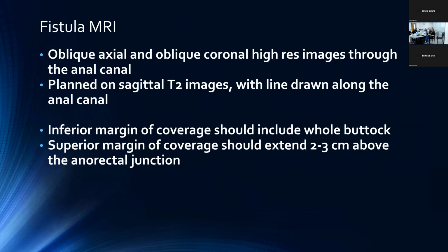So moving along to anorectal planned cases, we've decided to keep rectal tumor staging cases as RAD planned, just because these will not infrequently require review of both prior imaging and/or endoscopic notes to really localize small tumors, particularly post-treatment. They can be very challenging, and RADs will often miss the tumor as well. So these can be really quite challenging to correctly plan. However, fistula protocol planning is otherwise relatively straightforward.